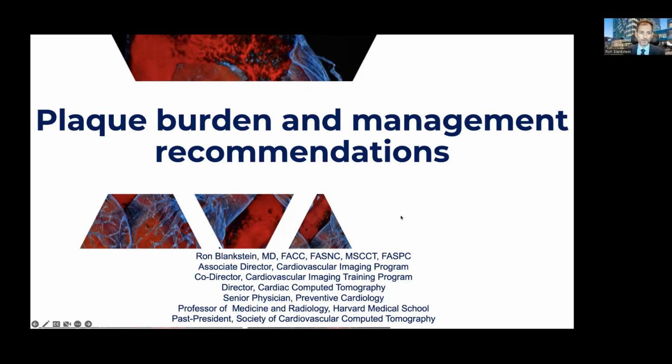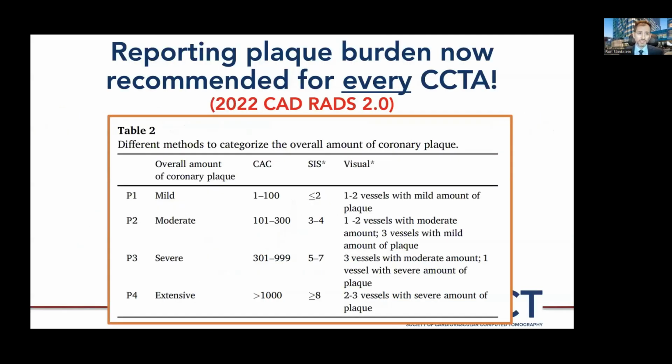Really a terrific presentation. I'm going to talk about plaque burden and management recommendations. I know Ricardo gave a really nice overview, and I would share with you that I think plaque burden is probably the single biggest change in this document when you look at the prior version. And in fact, plaque burden is now something we should report on every single coronary CTA, unless it's normal. If it's a CAD-RADS 0, you don't need to talk about plaque burden.